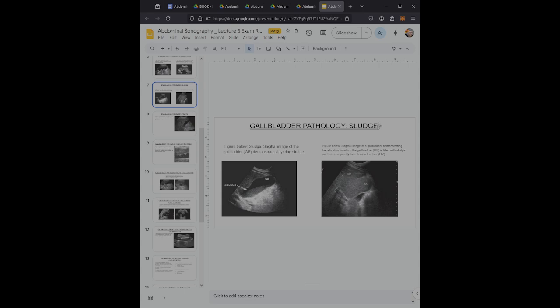The gallbladder can have sludge, and sludge can cause hepatization of the gallbladder. But sludge within the gallbladder is most commonly associated with biliary stasis. Sludge may be found in patients who have coexisting gallstones or a gallbladder carcinoma, and in those suffering from jaundice, liver disease, hyperalimentation, or sepsis. In addition, patients who have undergone an extended period of fasting or are on parenteral nutrition may also present with gallbladder sludge.